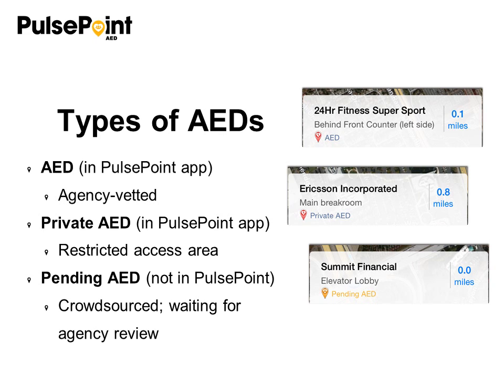There are three types of AEDs pertaining to PulsePoint. Agency vetted AEDs are in the PulsePoint app. Private AEDs are in a restricted access area, but are also in the PulsePoint app. A pending AED, which is not in PulsePoint, is crowdsourced and is waiting for agency review.